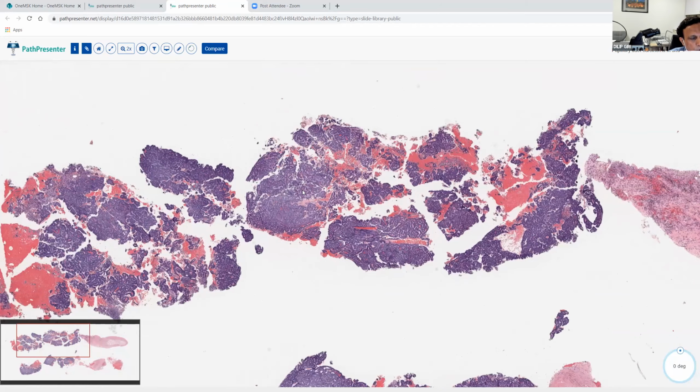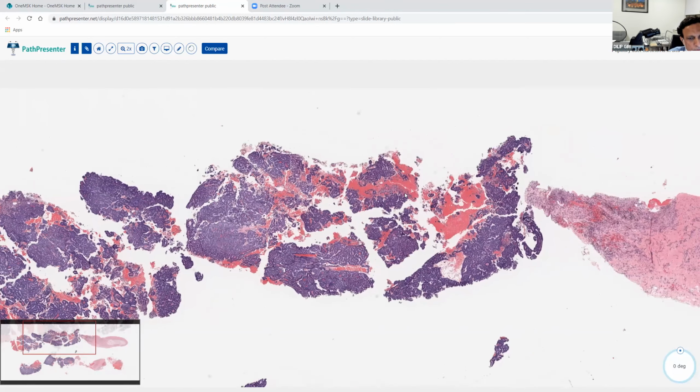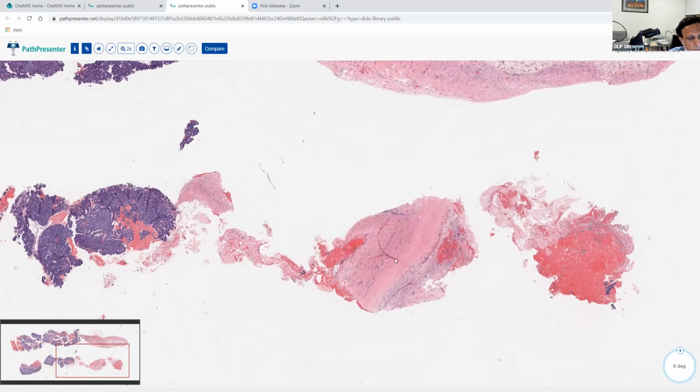On imaging, they probably have a better idea because they would have seen this as a cystic mass or something like that. If it is an overtly invasive type of papillary carcinoma, then it would not look like a cystic or nodular mass. It will look spiculated, or something along the lines of an invasive kind of process. The assessment of invasion, unless there is frank invasion that you can see in the stroma, I think should be left for the surgical specimen.